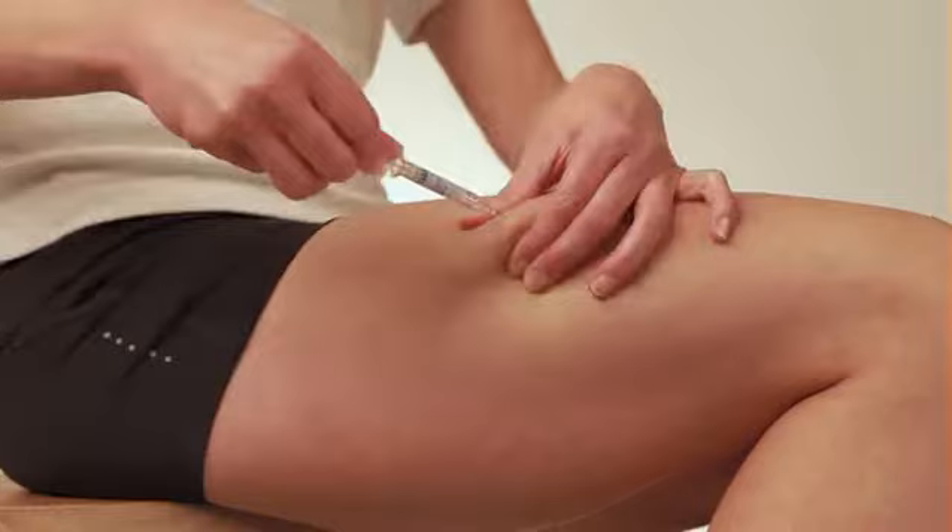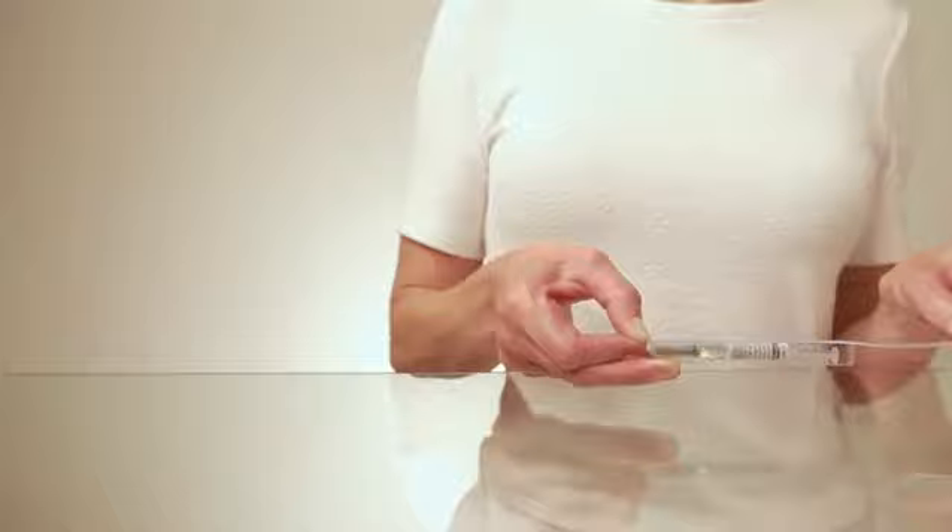Remove the needle from the skin fold and use a piece of gauze to press down and close the injection site. Throw away the syringe in the sharps bin and take a new syringe out of the packaging.